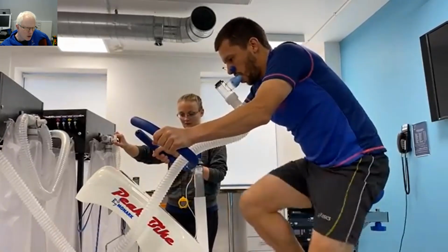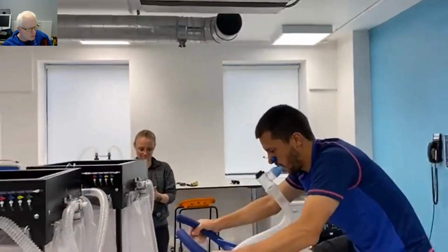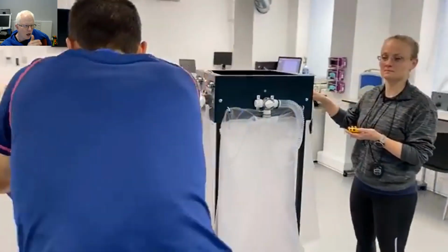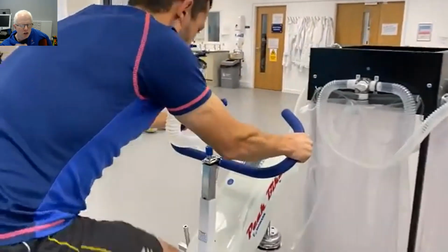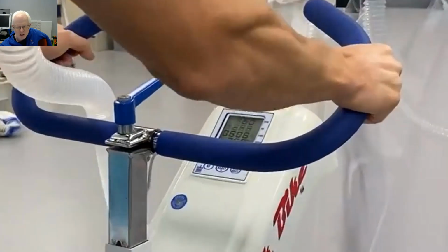He's building up a deficit. Viv is collecting the expired air into the Douglas bags, and we've got the Douglas bags all connected in series. All George is doing is maintaining a constant cadence against that fixed resistance. Remember, that resistance is 120% of the resistance he was working at VO2 max.